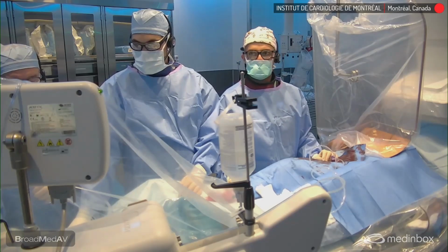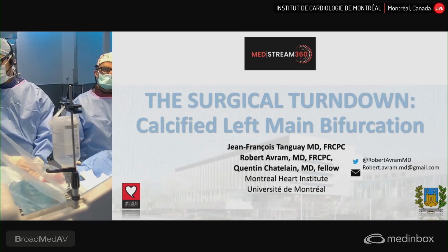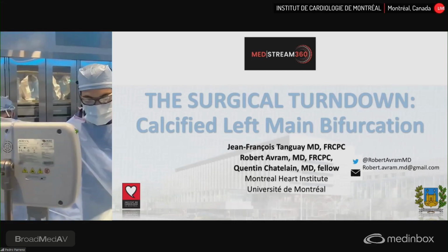So we have today a case of a gentleman that's a surgical turndown of a calcified left main ostial circumflex lesion.